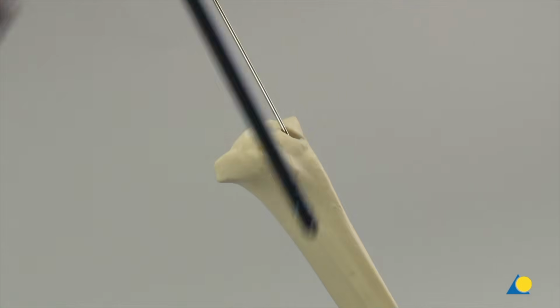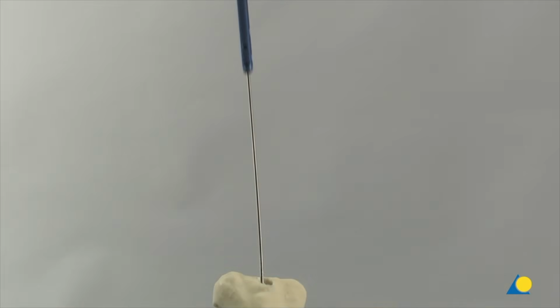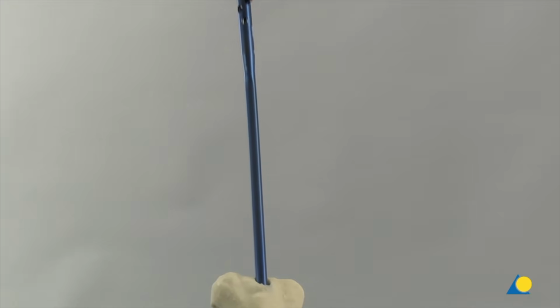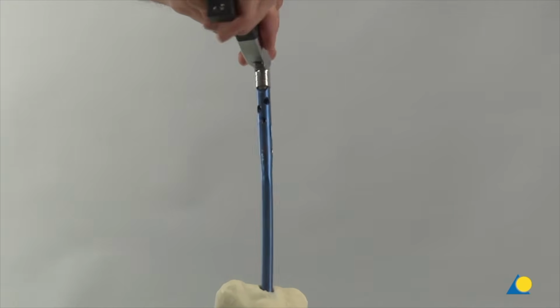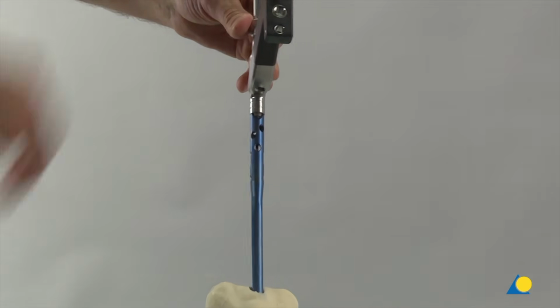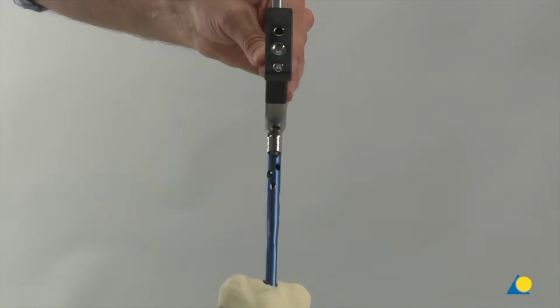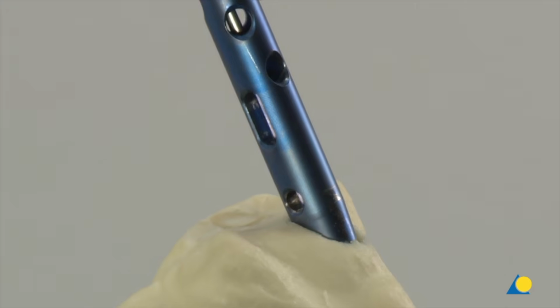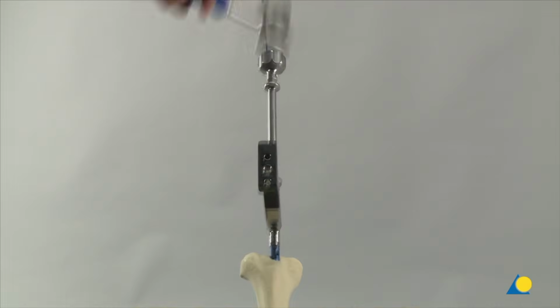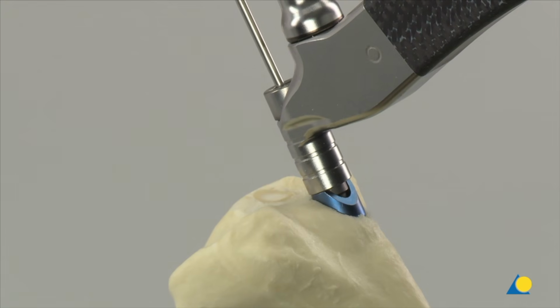The nail is inserted over the guide wire into the intramedullary canal. A wriggling motion can be used to advance the nail. If needed, light, controlled hammer blows can be used to seat the nail. The passage of the nail across the fracture is monitored and controlled with image intensification in 2 planes to avoid malalignment. The nail should be inserted until it is at or below the tibial opening.